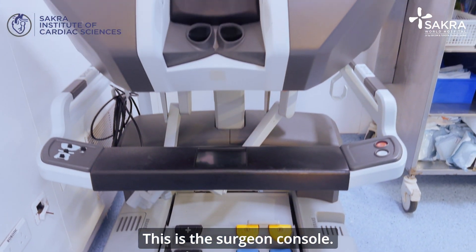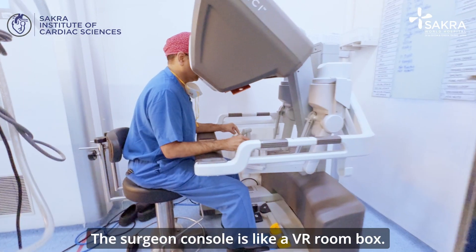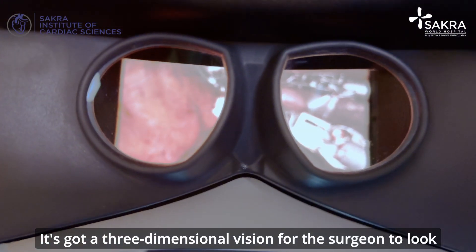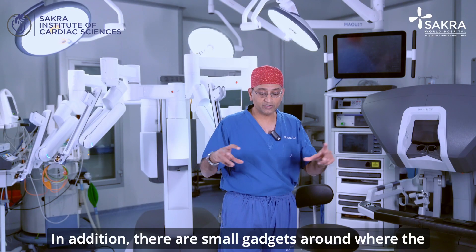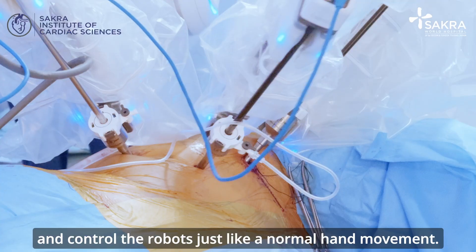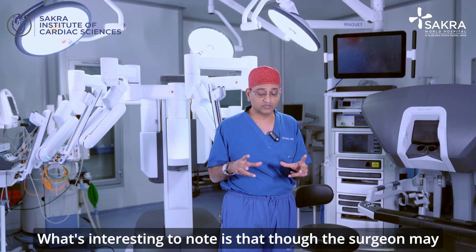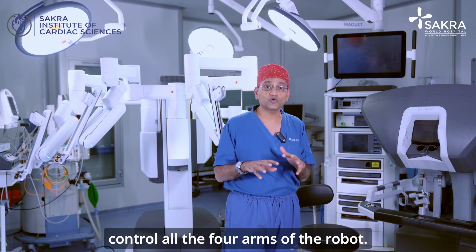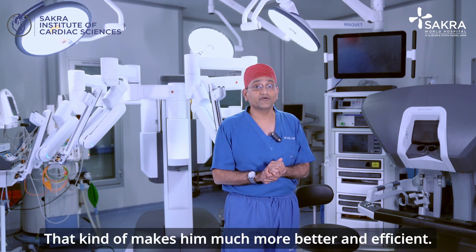The second part is the surgeon console. The surgeon console is like a VR room box — it has three-dimensional vision for the surgeon to look inside and see whatever is happening at the patient side. In addition, there are small gadgets where the surgeon can put his fingers inside and control the robots just like a normal hand movement. What's interesting is that though the surgeon may only have two hands, he can simultaneously control all four arms of the robot, making him much more efficient.